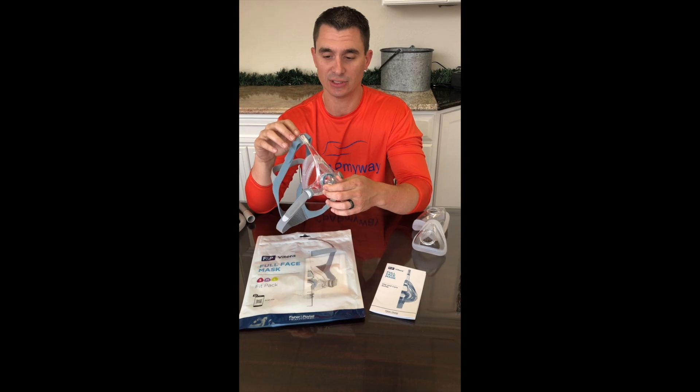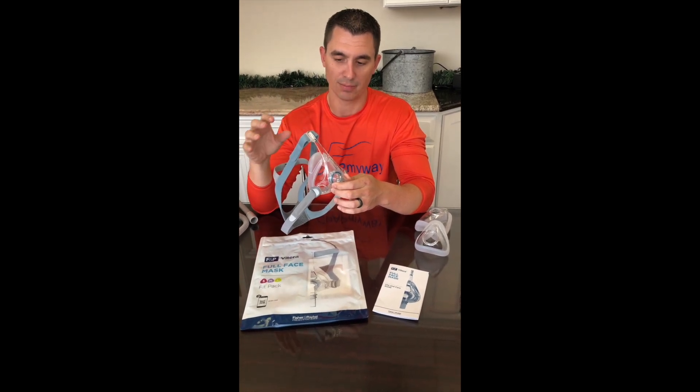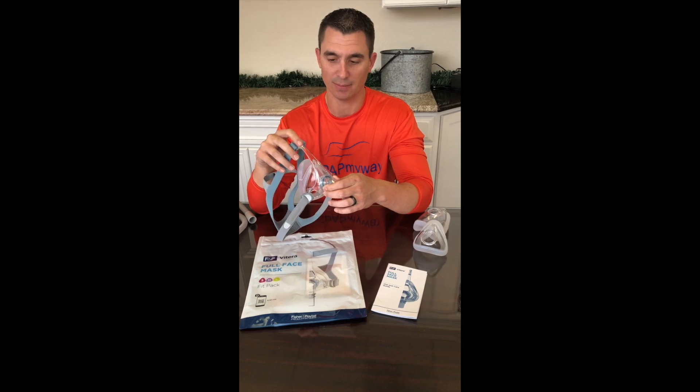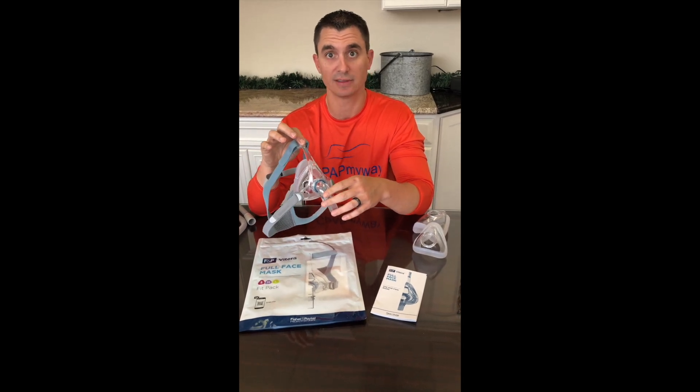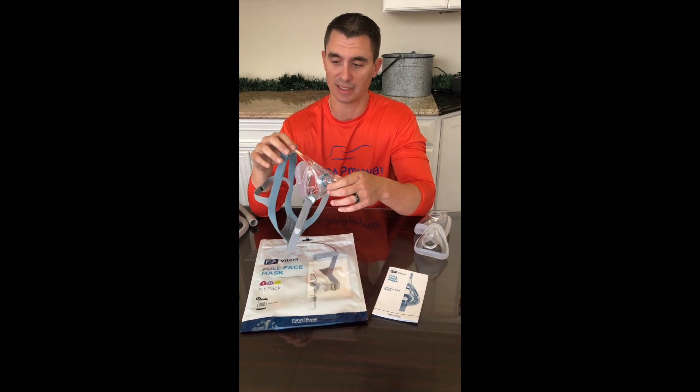There are some really nice features that make this mask leaps and bounds better than the Simplest. So a lot of people that are on the Simplest are going to want to consider checking this mask out, just because of the really nice improvements.